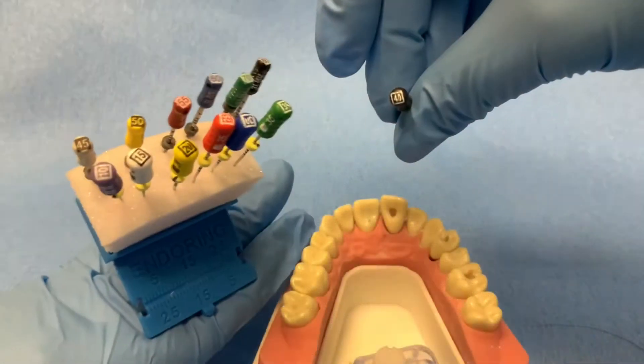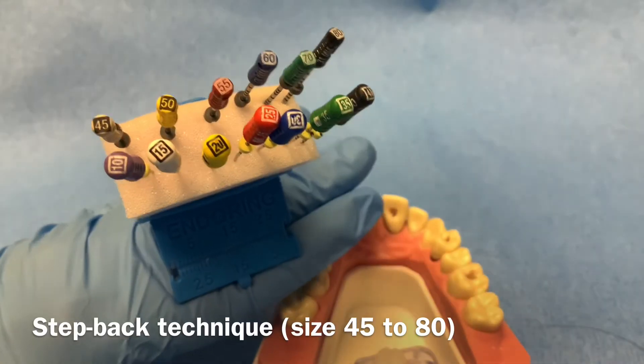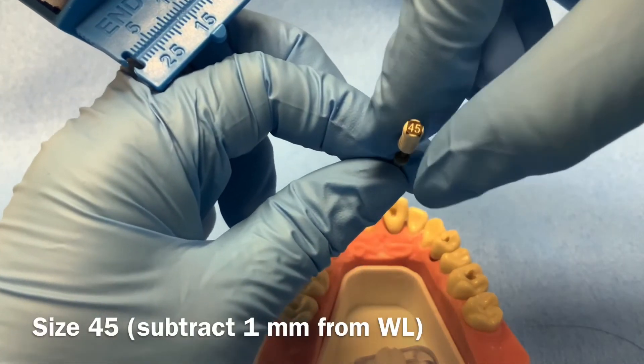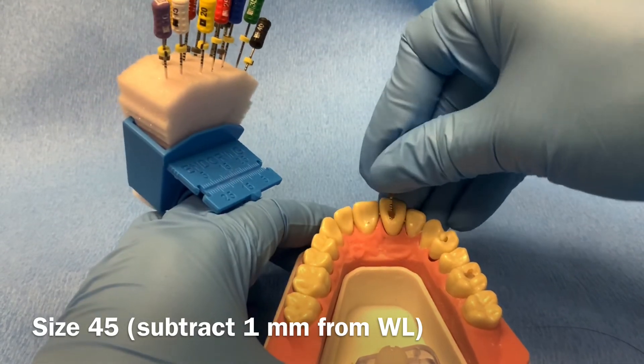In the previous step, we completed apical preparation to a size 40 k-file. In this step, we will use size 45 to 80 k-files. During the step-back technique, the working lengths will decrease in a stepwise manner with increasing instrument size. For example, if you completed apical preparation at a working length of 25mm with a size 40, for step-back you will use a working length of 24mm for the size 45 file. The step-back technique will shape the remaining portion of the canal to allow for better irrigation and ease of obturation.